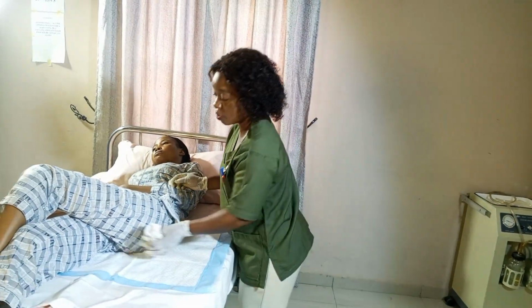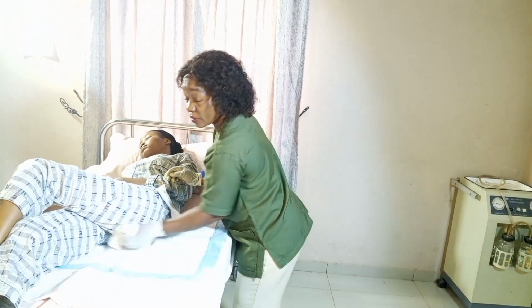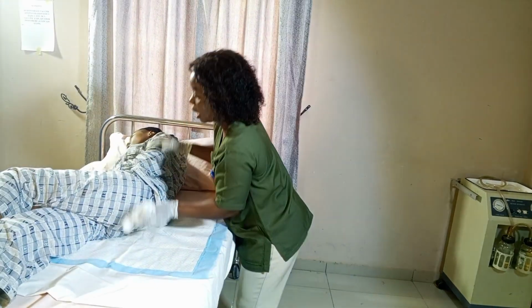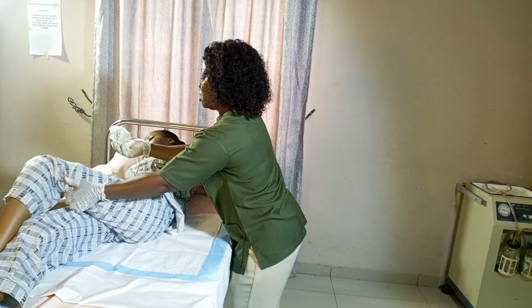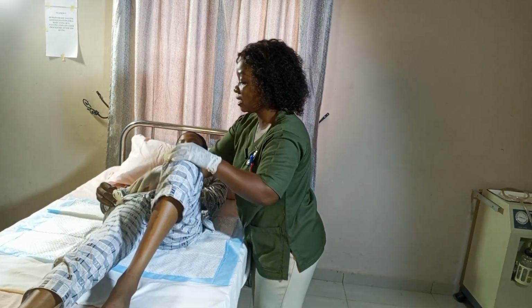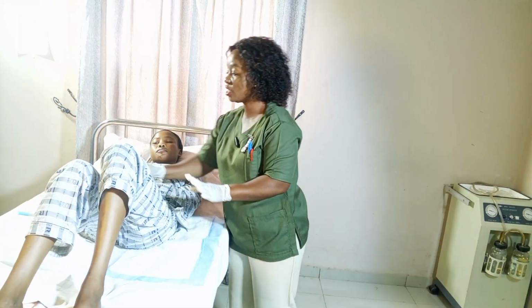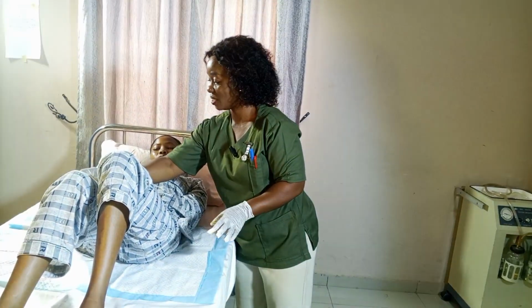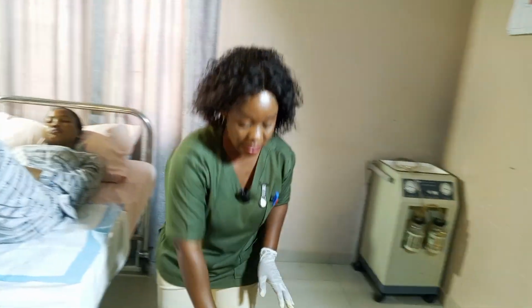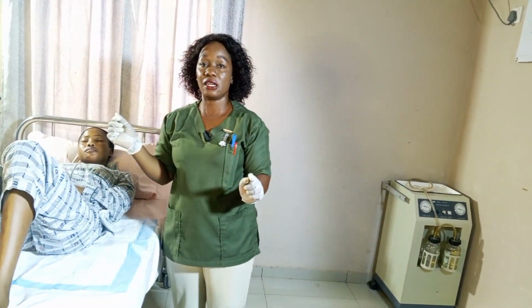You assist the patient from up, right, from the vagina, then to the anus, right? From up, down, right? This way, you assist the patient up, down. But if the patient can, you give the patient the tissue, right? And you ask the patient to open her legs, and then she cleans up herself by herself, right? When she is done, let's assume that she's done with cleaning herself, and she gives me, I discard it inside the bedpan, isn't it?